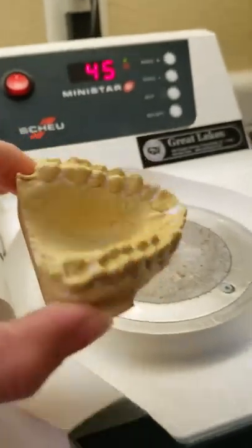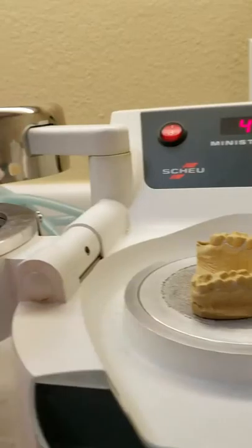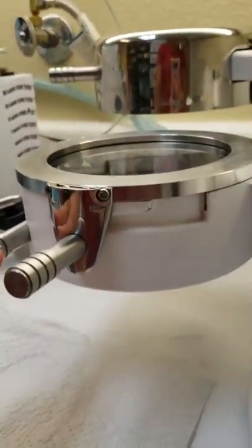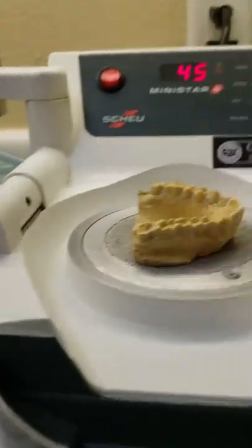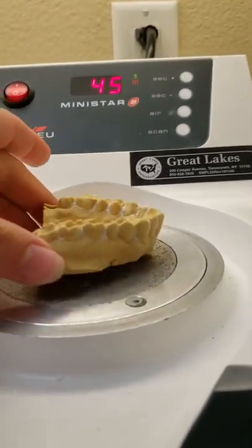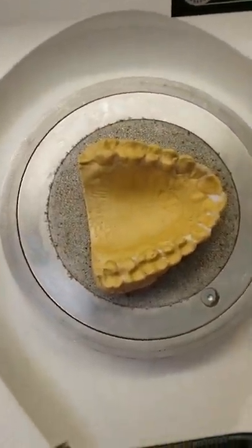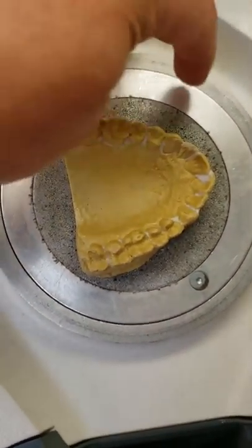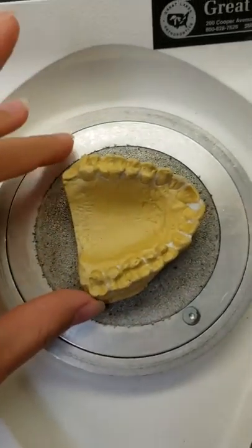Take your model and center it on the platform. You don't want a big base on the model for an Essex retainer, because if it's too tall, the plate won't close all the way when flipped over and the latch won't shut. You want a little bit of a base, but it doesn't need to be super thick — just get it centered on the textured plate and you're good to go.